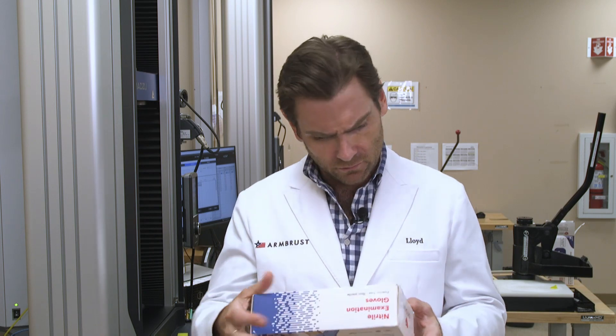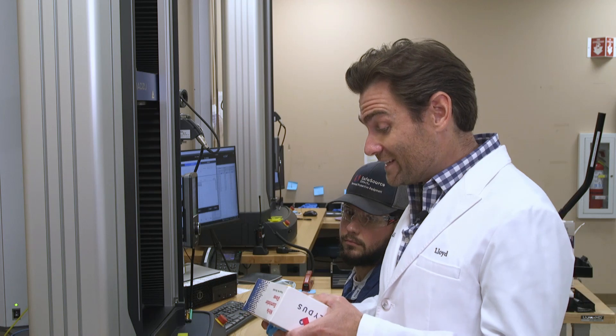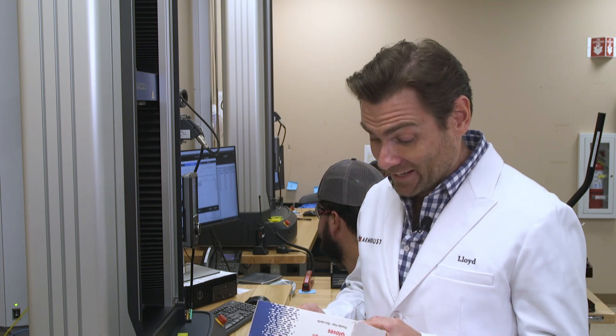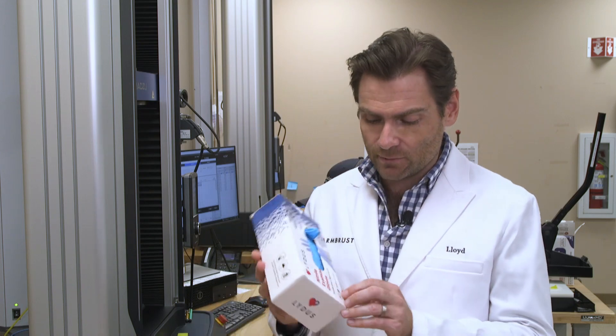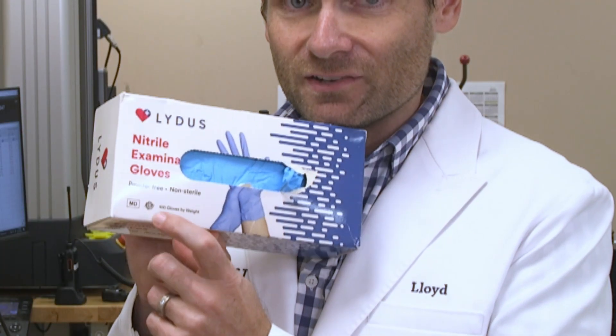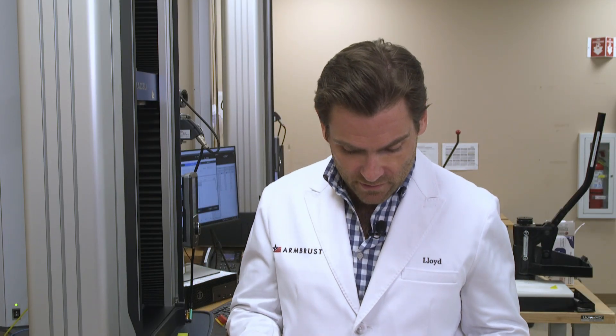Let's take a look at these guys. It says 510K cleared — that's the FDA's designation for a class one medical device, which means it's gone through a huge process. It does have the ASTM logo on the box, which I know ASTM does not want you to put there — you have to say 'member' underneath it. So that's one strike against them. The gloves were manufactured in Thailand, which is great — they make some of the best gloves in the world.